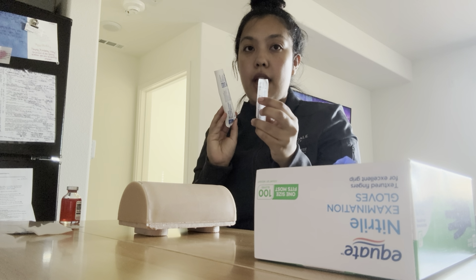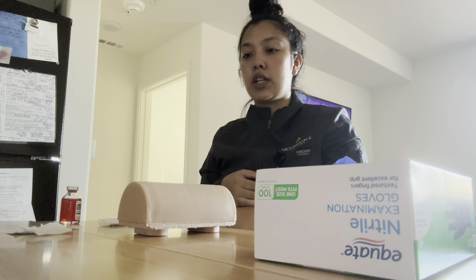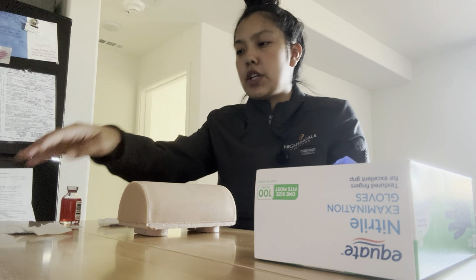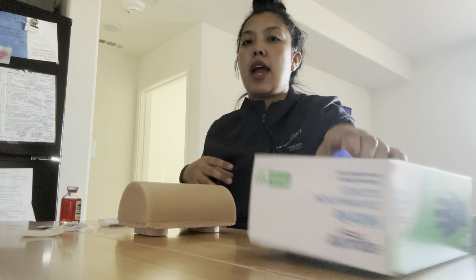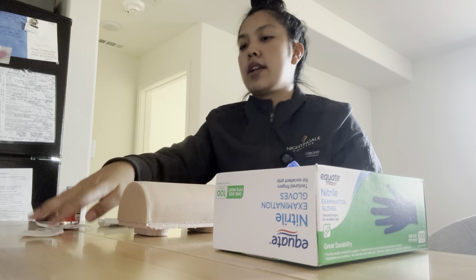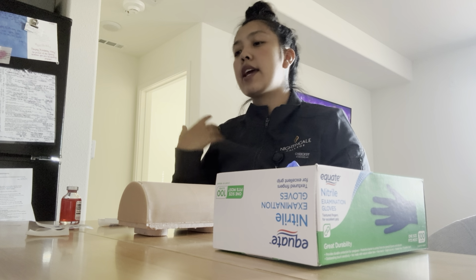Then I'm going to make sure I have the correct syringe, which is 3 mL. I have the correct needle, which is 25 gauge 1 inch. Typically, if the patient is a little bit larger, you would use like 1.5 inches, but my patient is not that large. I have some gauze, a band-aid just in case, alcohol prep pads and my gloves. Then I'm going to knock on the door for the patient's room after I have all my supplies. Enter the room, close the door, hand hygiene, introduce myself.